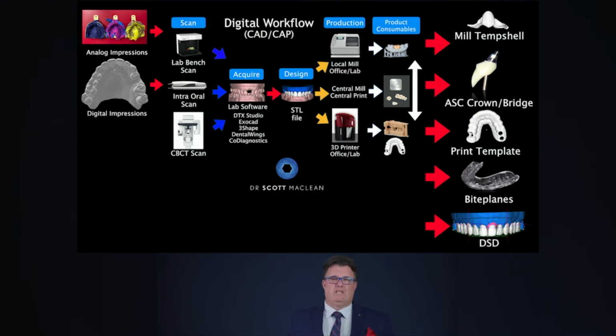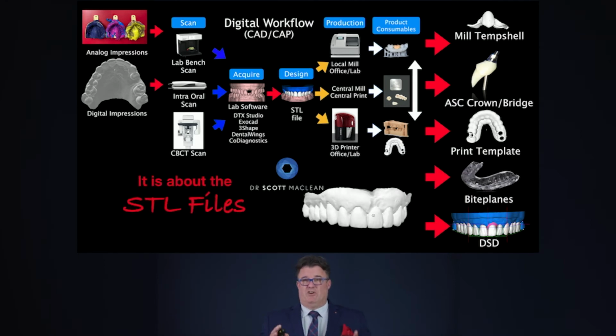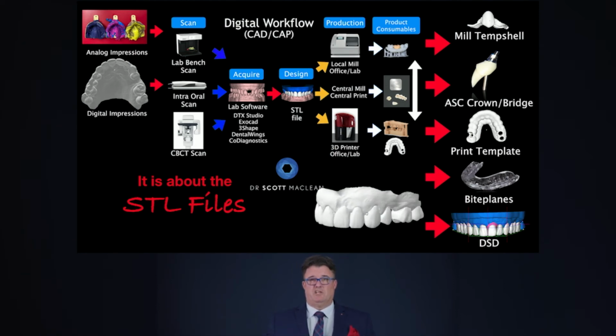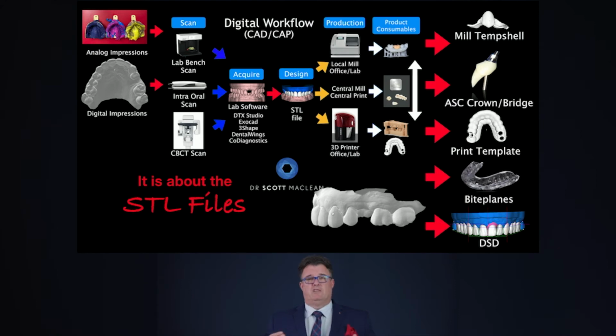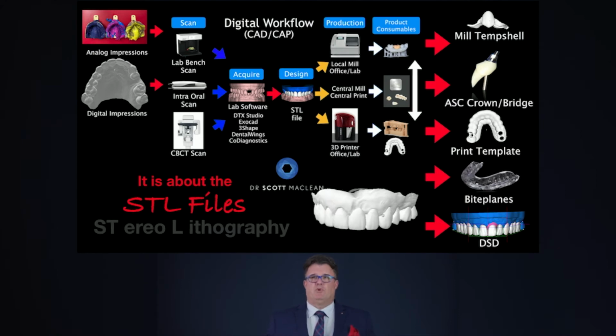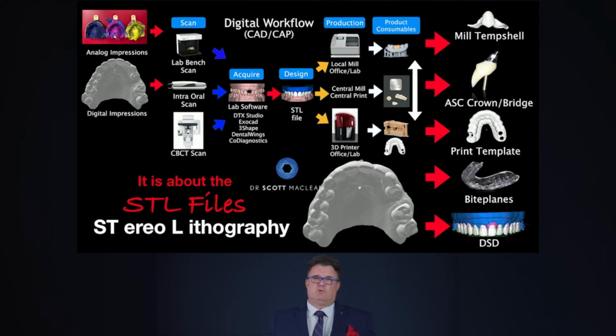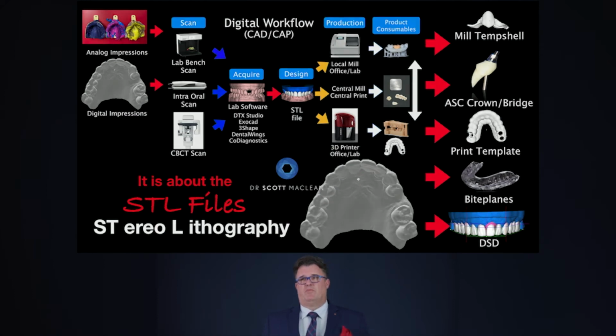There are so many different ways that I'm not talking about today, but these are some of the things that dentists are doing with this type of technology. Folks, it's all about the STL file. That's really what we're trying to produce. That's what people are buying and selling, STL files. They're also selling and buying the final product, but sometimes we're getting in on the digital workflow at different points so that we can make this really work well in our own office.